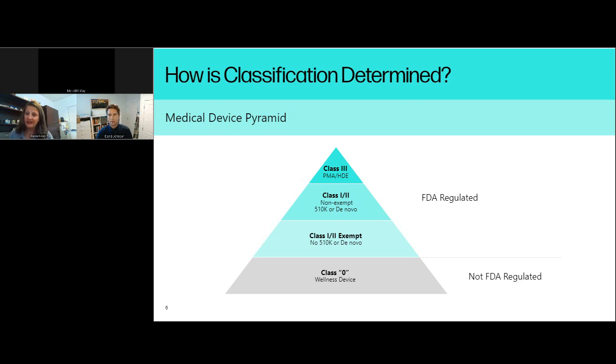A Class 3 device, it is the safety measure to ensure that the device is safe to go on to clinical trials, which is the measure of efficacy in a Class 3 device. So that's where mechanical testing happens. So a bulk of our product is Class 2 devices, but we love seeing Class 3 devices. We're very active with new technologies that don't have an ISO or an ASTM standard and developing specific protocols to identify failure modes and longevity of the device so that we can present that information to the FDA or other regulatory agencies to show safety and efficacy.